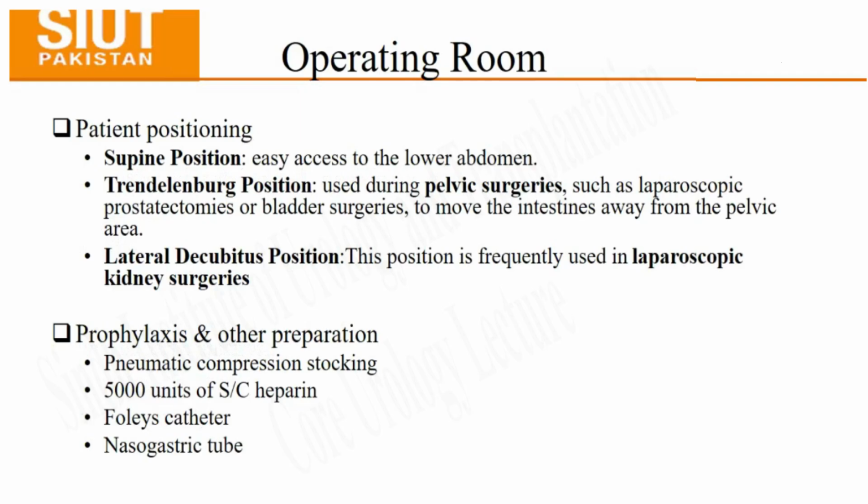Whenever we are trying to define some sort of contraindication, we have to choose our words wisely. It's being said that whatever can be performed by open technique can be performed with laparoscopic or robotic surgery.